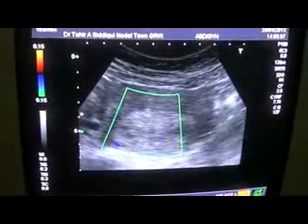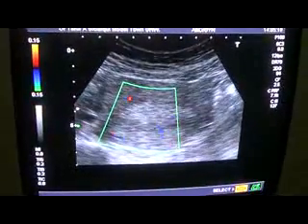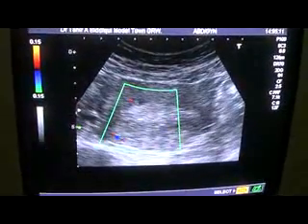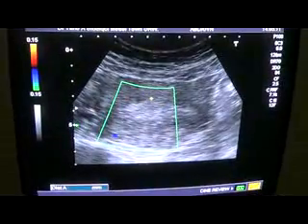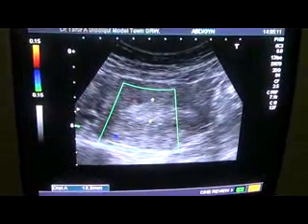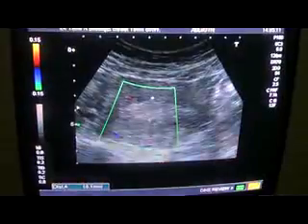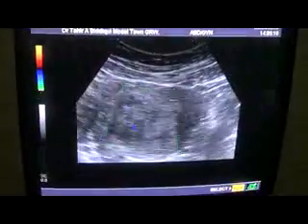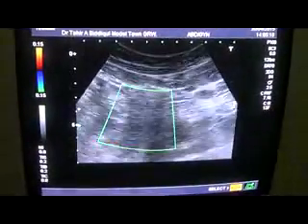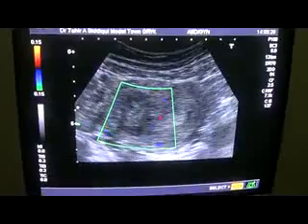This is the transverse section. See the thickness of the endometrial canal again — we are going to measure from here. Again, 16.1 mm — more than 14 mm is considered abnormal.